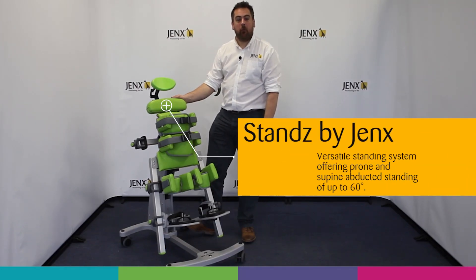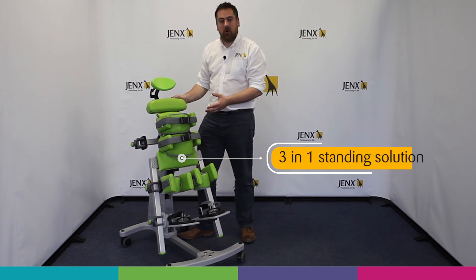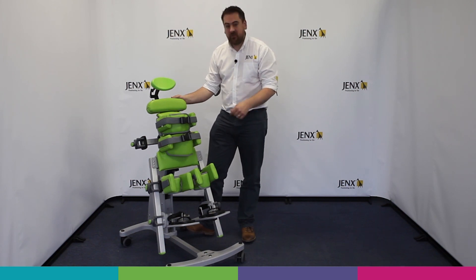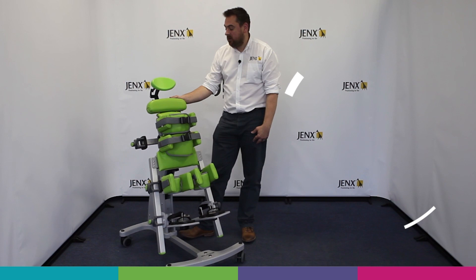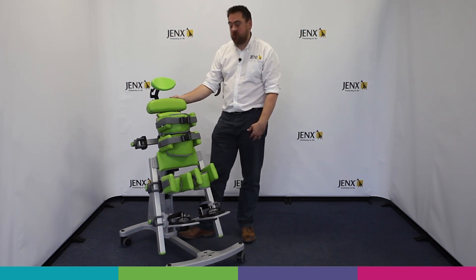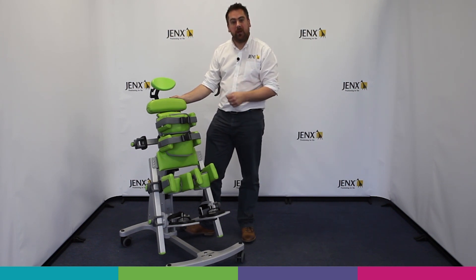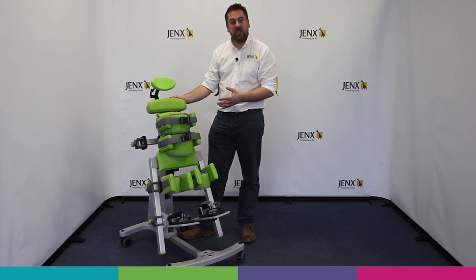In this video we're going to have a brief introduction to Stands by Jenks. Stands offers a three-in-one standing solution, offering prone, supine, and upright positioning for children with a suggested age range of between 18 months and nine years. Full sizing details can be found in the Stands brochure. Stands is an ideal product for those environments where you may want to share one product between a number of different children.